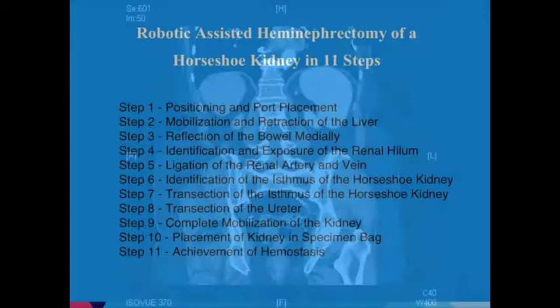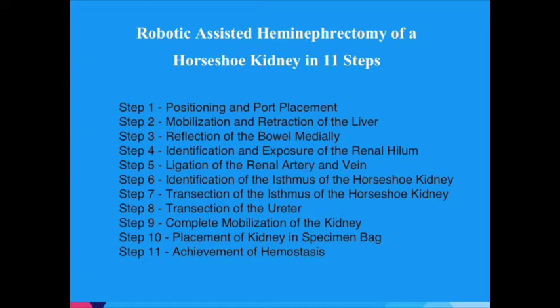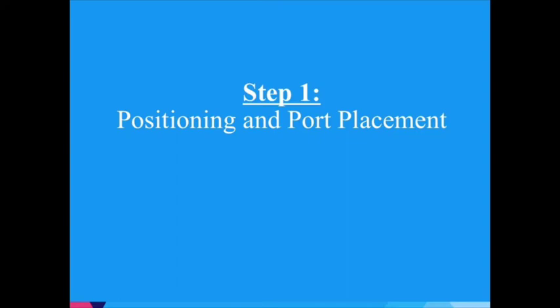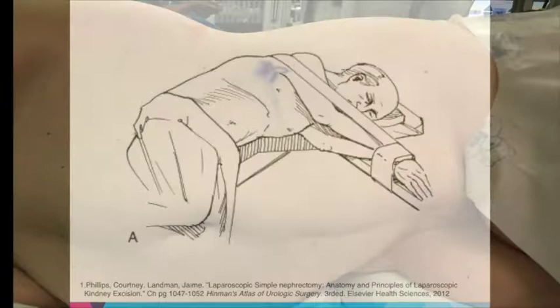After a discussion of all possible treatments, the decision was made to proceed with robotic-assisted heminephrectomy of the horseshoe kidney. The technique will be described in these 11 steps. The patient is placed in the left lateral decubitus position with the help of a bean bag. All pressure points are padded and the table is flexed slightly to open the abdominal space.